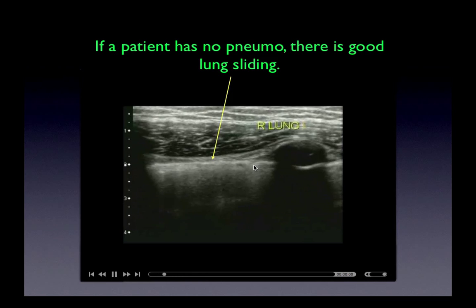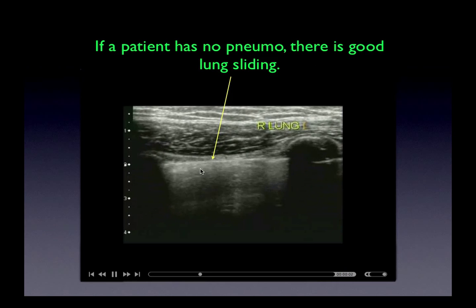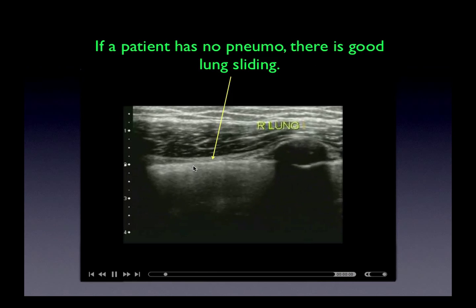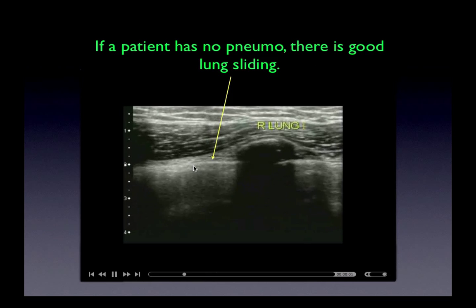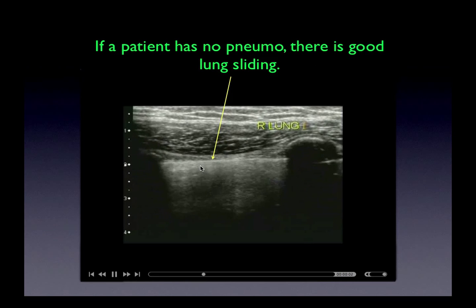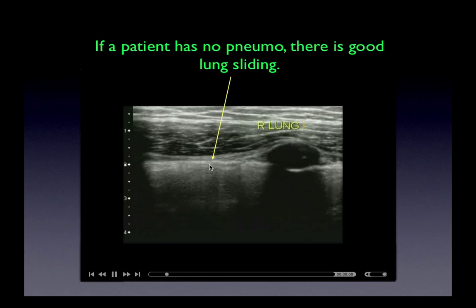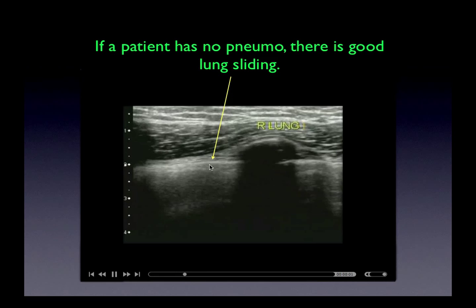This shimmering of the interface has been described as ants marching along, or merely motion that is visible.